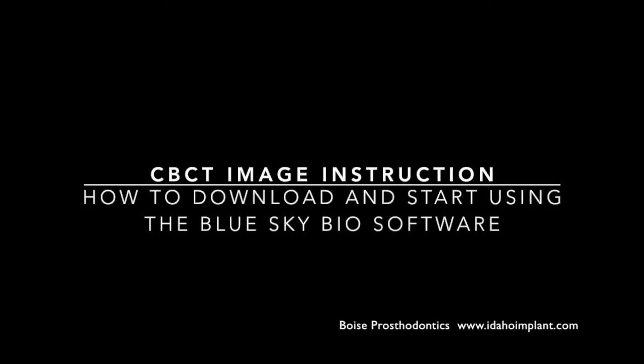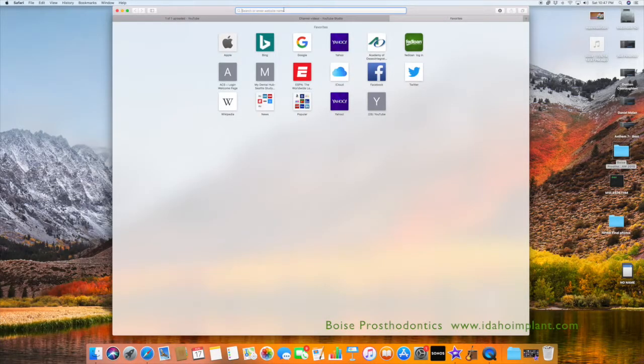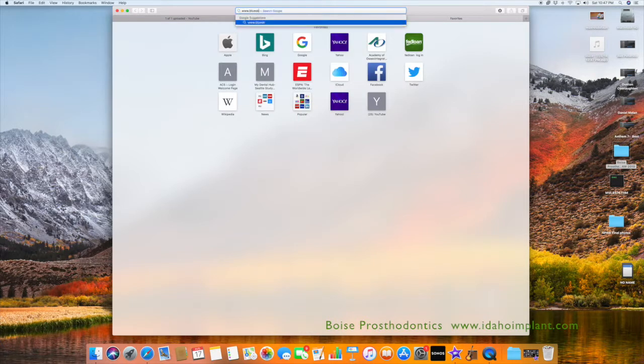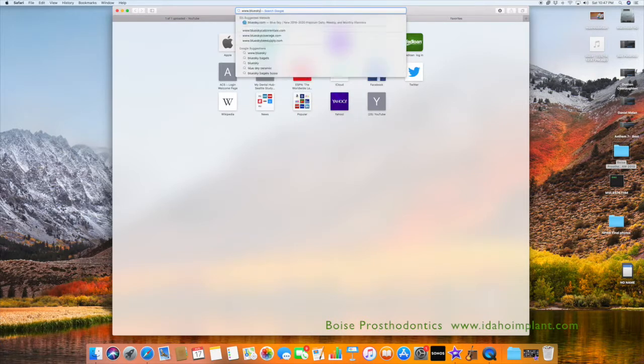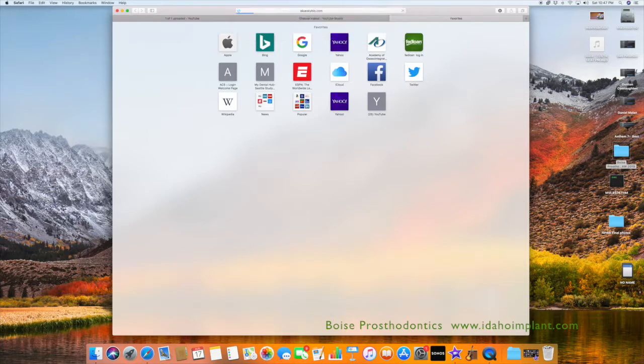This video will demonstrate how to download the BlueSkyBio software. First, you'll open your browser and type in BlueSkyBio.com.